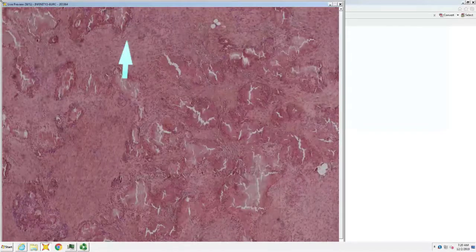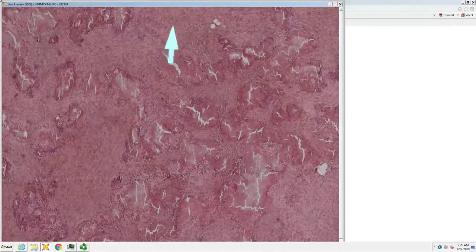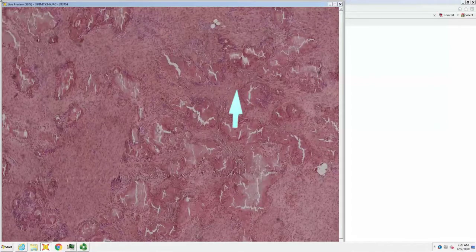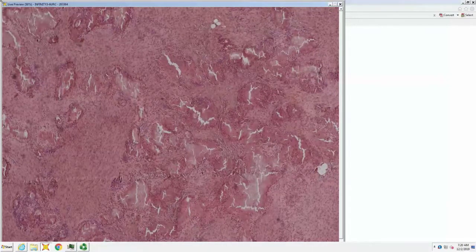Excellent. So calcifying aponeurotic fibroma. You have fascicles that tend to run in a common direction, not the interlacing storiform fascicles. And you have the palisades around calcifying centers, very characteristic for calcifying aponeurotic fibroma, which may shock you but tends to occur on the aponeurosis. So where's the aponeurosis? Aponeurosis is the flattened out part of a tendon, right? So commonly palmar and sole is where you see that.